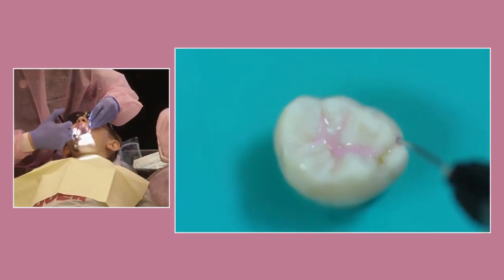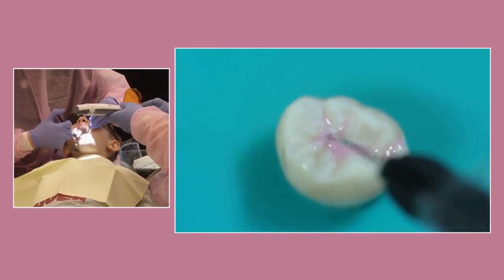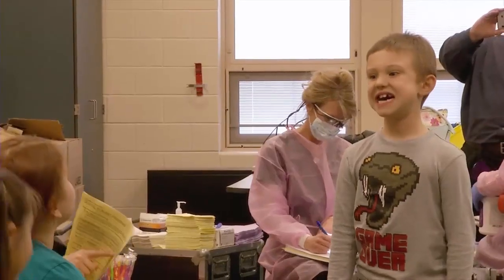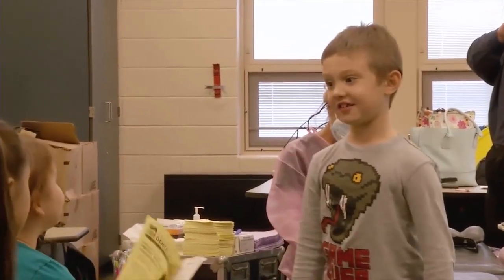The sealant is painted on your teeth. Then a special light is used to harden the sealant so it will stick to your teeth. After the sealant has been hardened, you can immediately eat, drink, and chew food.